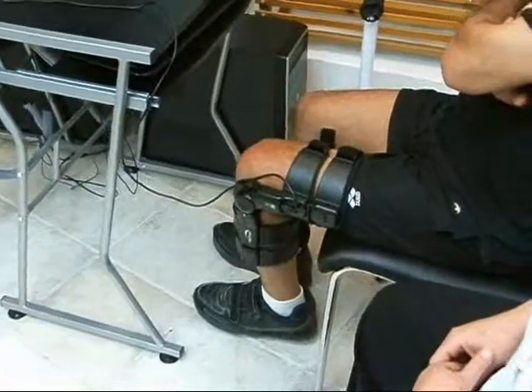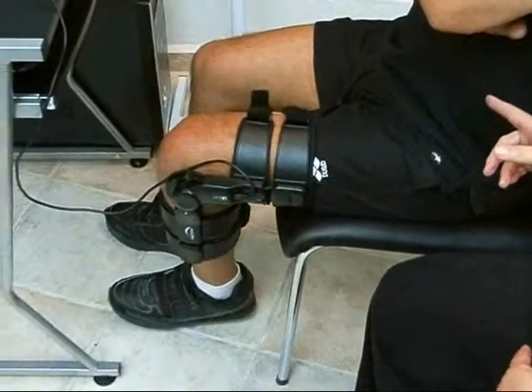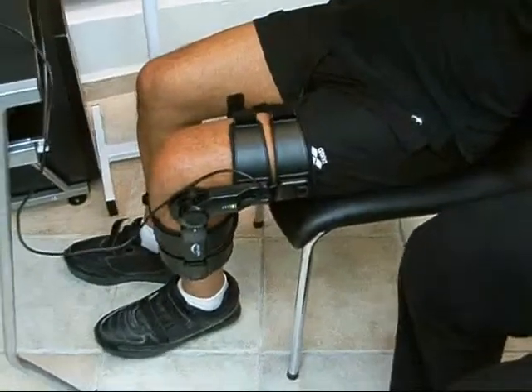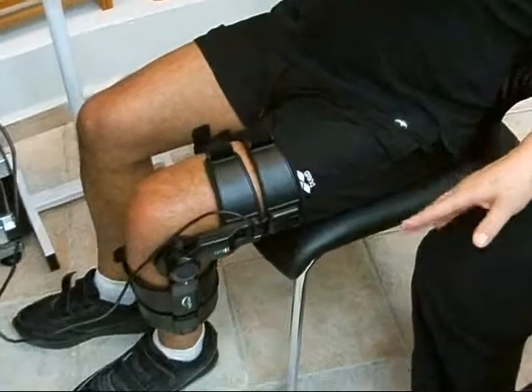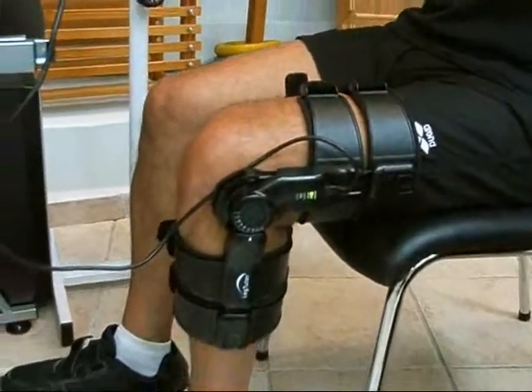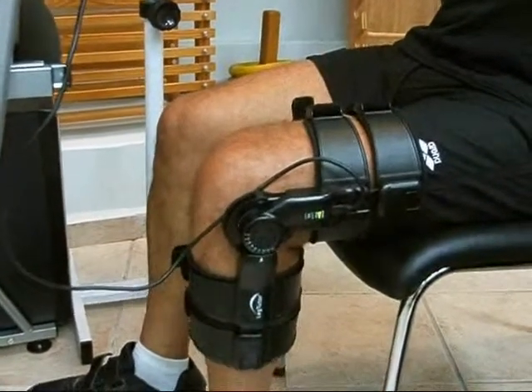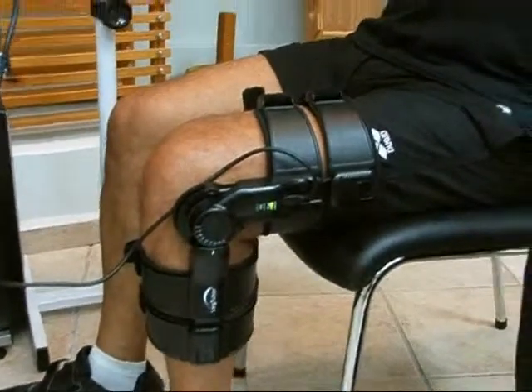The Leg Tutor is indicated for leg movement dysfunction following neurological or orthopedic injury and disease. Here you see the patient performing intensive active hip flexion and extension exercises in the sitting position according to his movement ability.